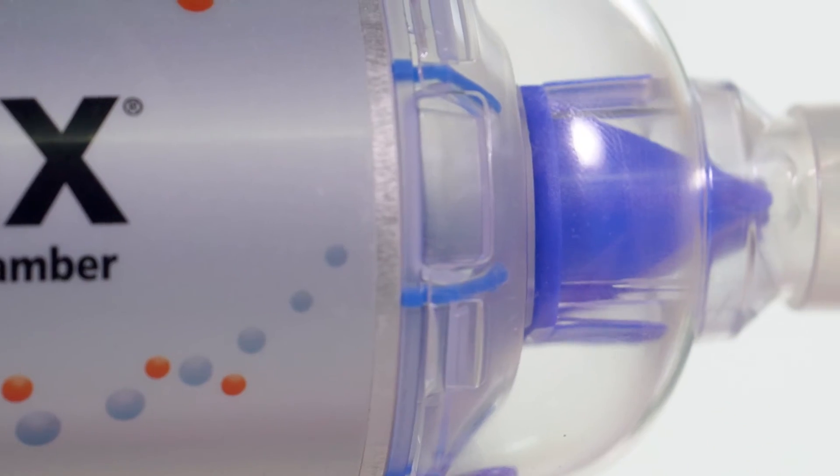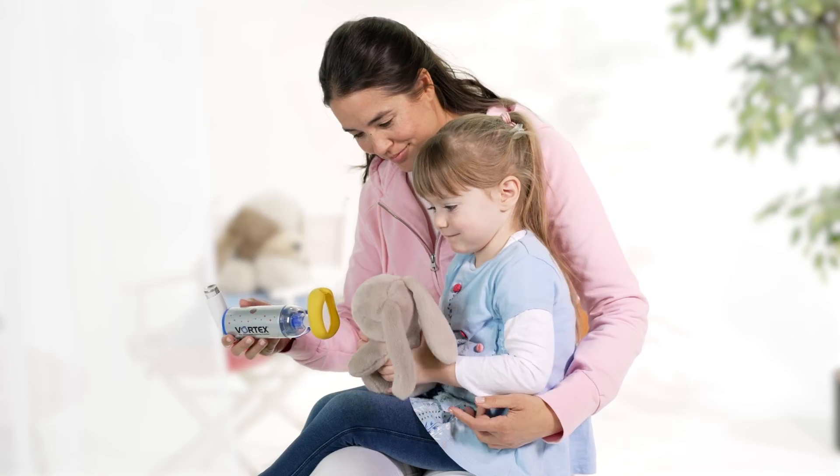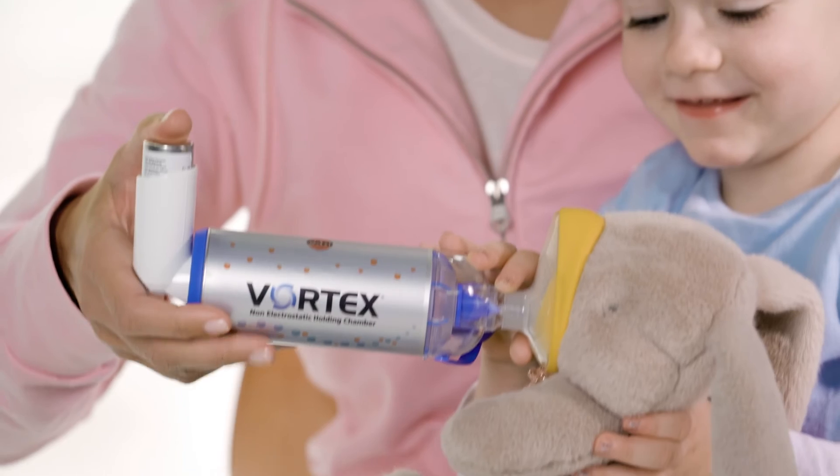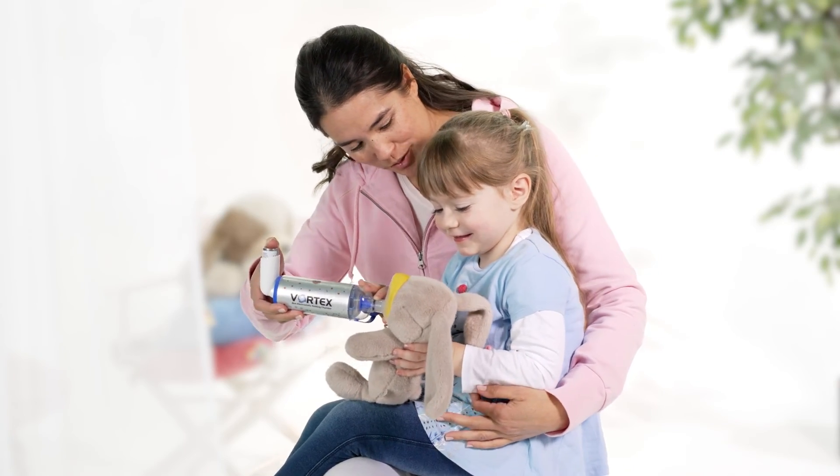You will see the valve opening when they are breathing out. To guide children through inhalation, they can be shown how to use the device on a doll or a stuffed animal.